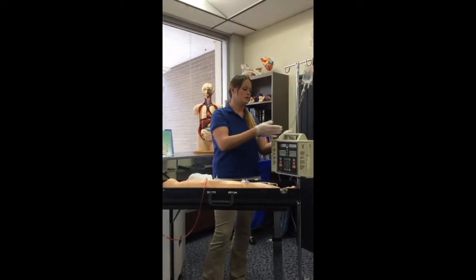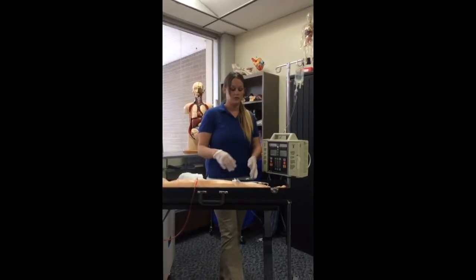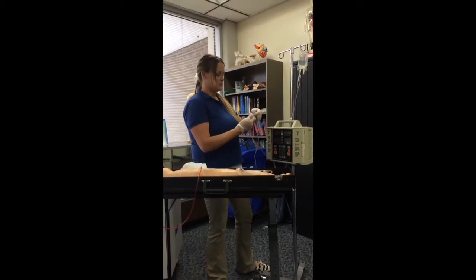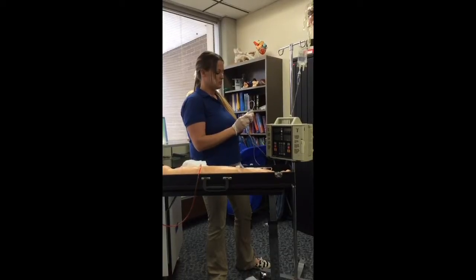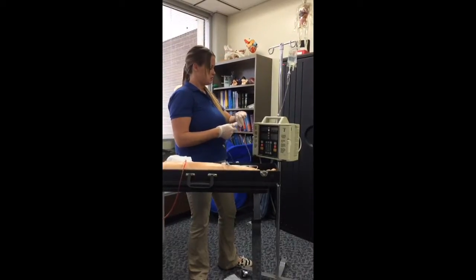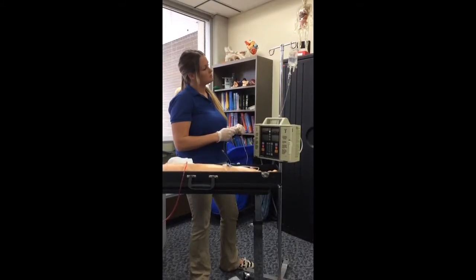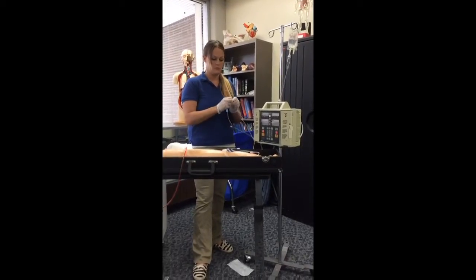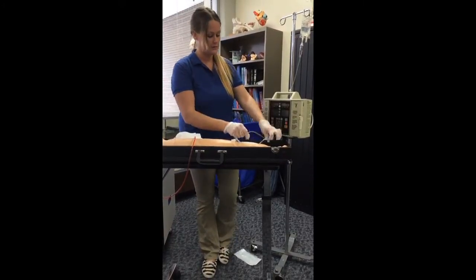Now I need to determine in the beginning my drop factor, my drops per minute, which would be 17 drops per minute. So now I'm going to unclamp and then I would determine 17 drops per minute. And once I've determined that, I will unclamp everything and let the medication run for an hour.